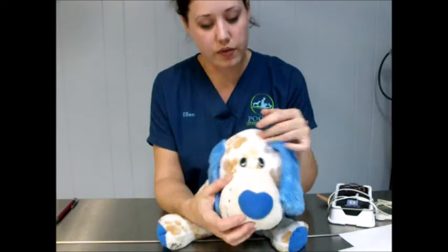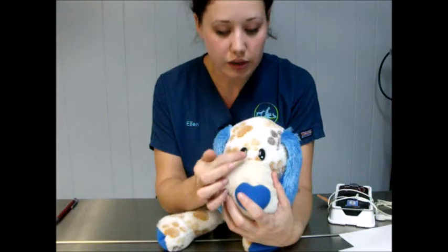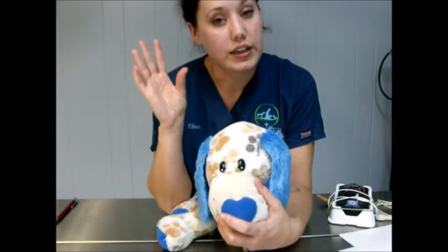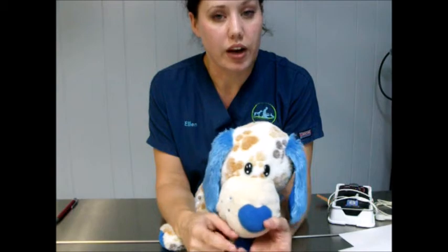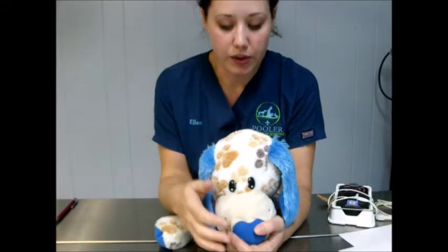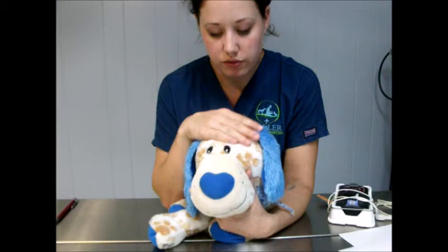Then moving on to the eyes, the palpebral or blink reflex. You would be touching the medial or the lateral canthus of the eye, just a little touch, looking to see if they have that blink. That's going to be apparent when they're light and to some medium depths. Depending on how deep they are, they will have a little bit of a blink, so that's a pretty good indicator of depth.